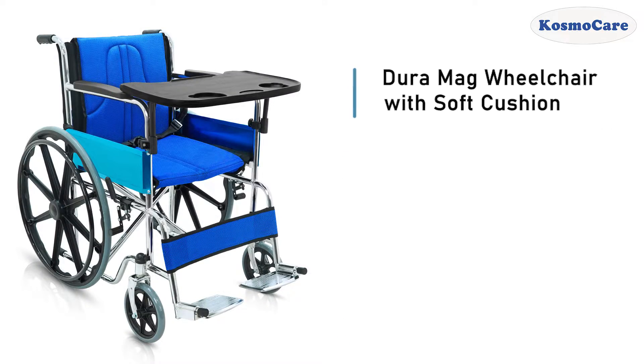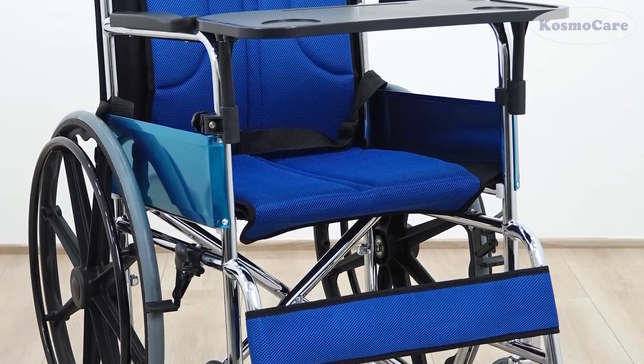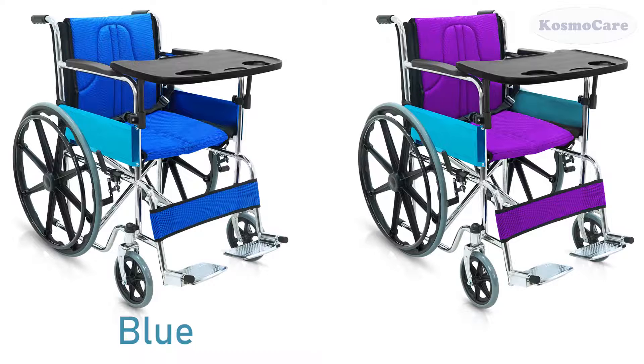CosmoCare Mag wheelchair with soft cushion offers a durable and dependable mobility solution to users to support independent living. It is available in two attractive color options, blue and purple.